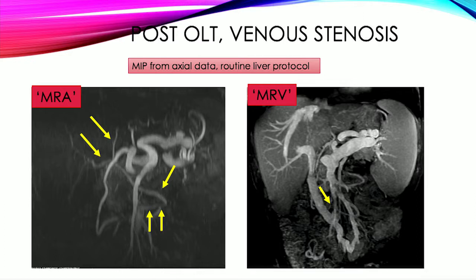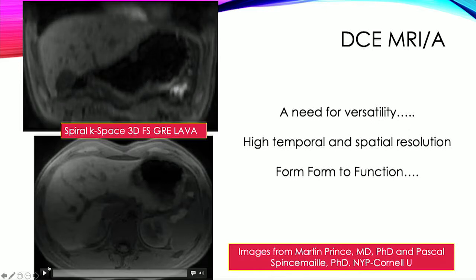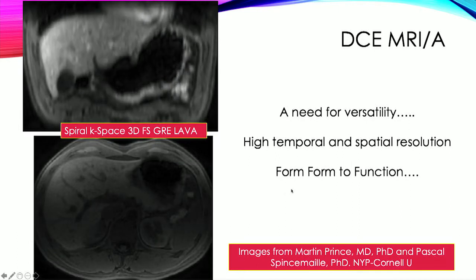And that is challenging unless you use more accelerated techniques. And since they're becoming more available, that is very helpful. But even these techniques, these are non-Cartesian techniques. We've heard about radial imaging. This is an example of spiral imaging borrowed from Martin and his group.